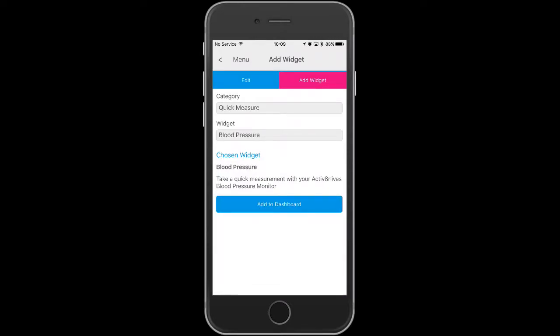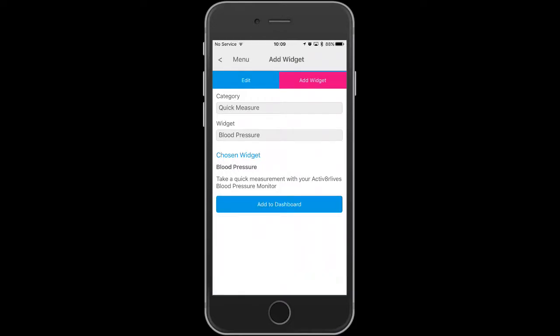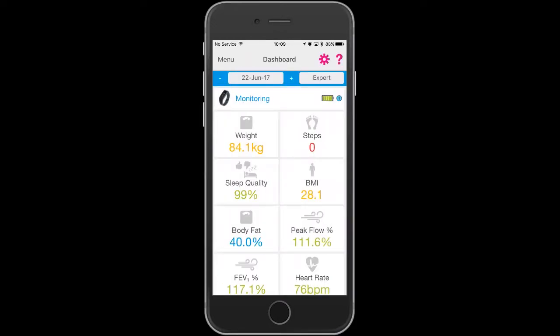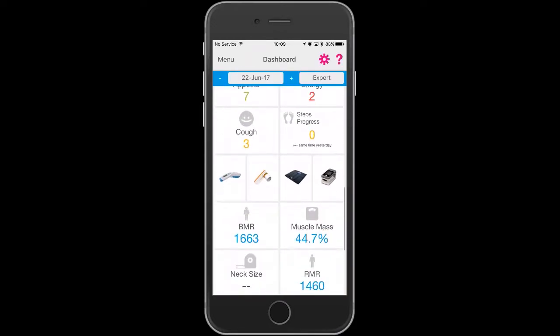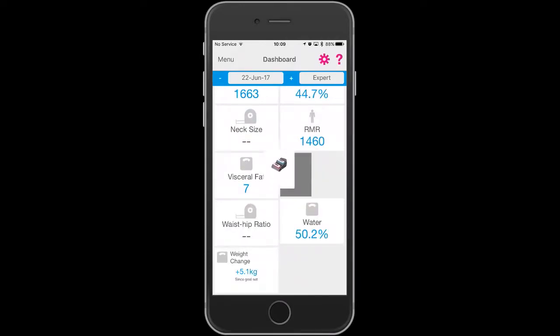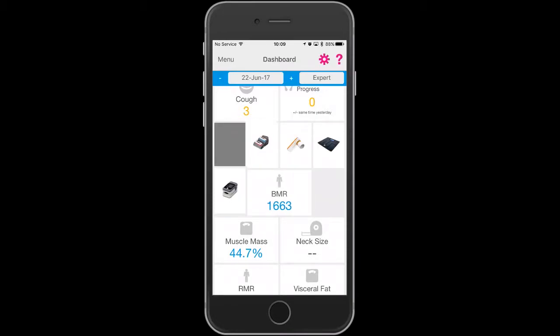For the widget, you want to select the blood pressure one. You will find it now appears at the bottom of your dashboard. You can move it anywhere that is more convenient within your dashboard.